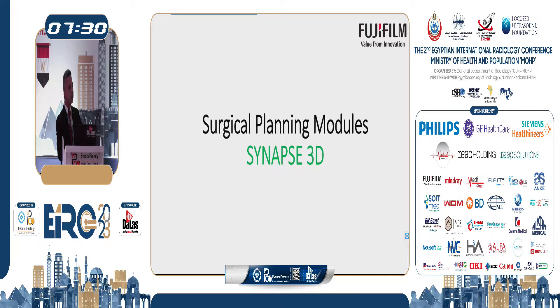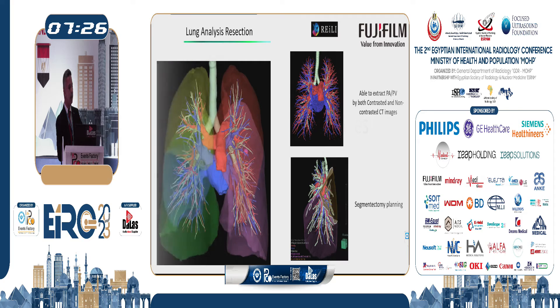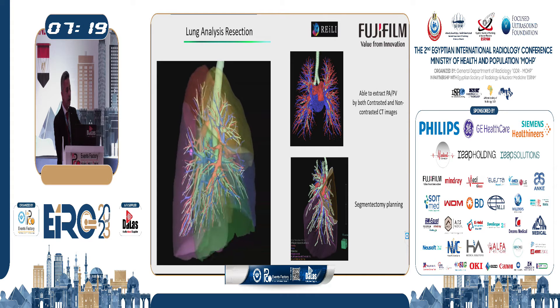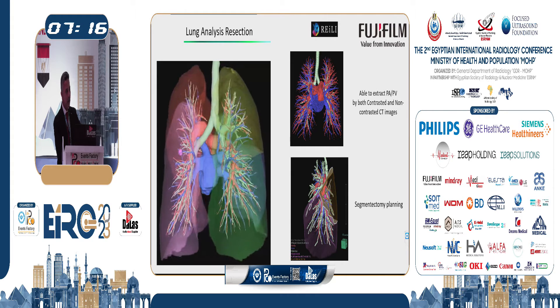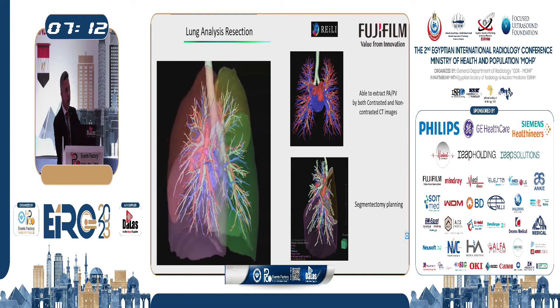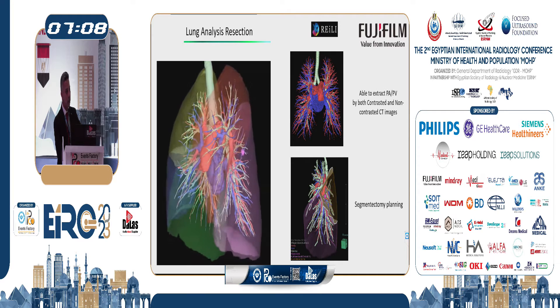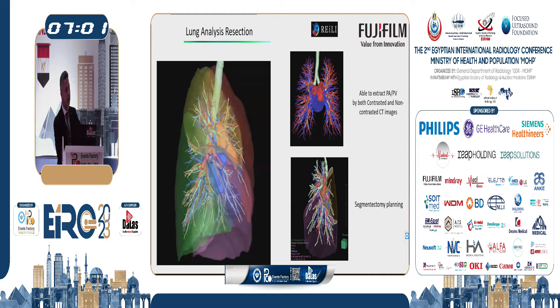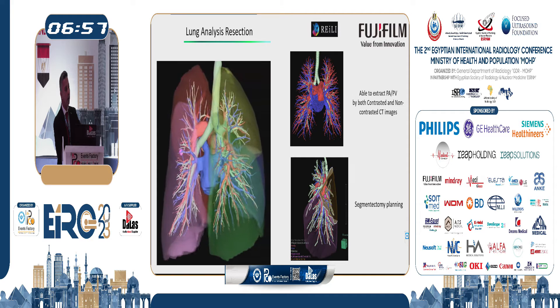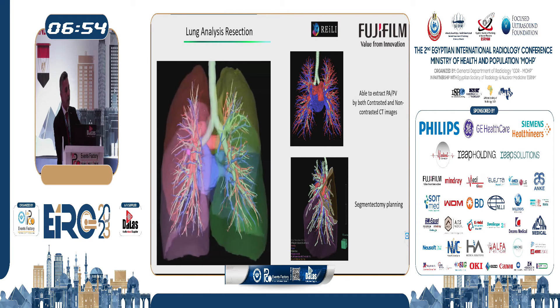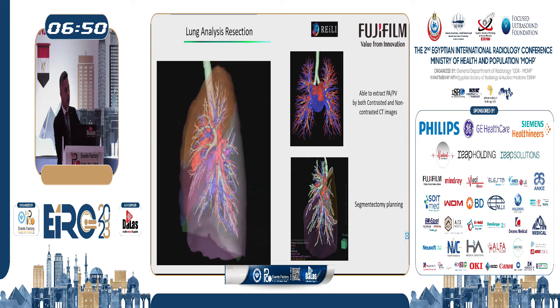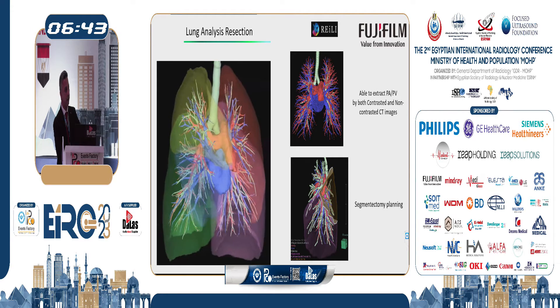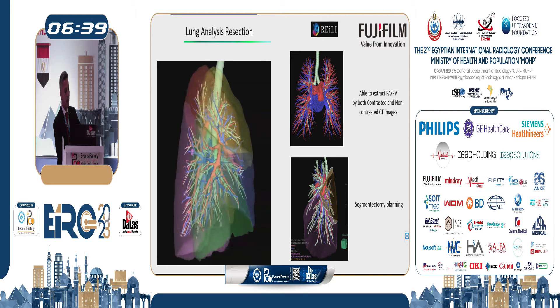The first module is the lung resection station. In lung cancer resection, the separation between the pulmonary vein and pulmonary artery is very difficult due to their similarity and complex structure. With Synapse 3D, it requires only one click to extract all pulmonary veins, pulmonary arteries, both lungs with their lobes, and all vascular structures including trachea, bronchus, and bronchioles. Notably, Synapse 3D can extract these structures even in both contrast and non-contrast imaging.